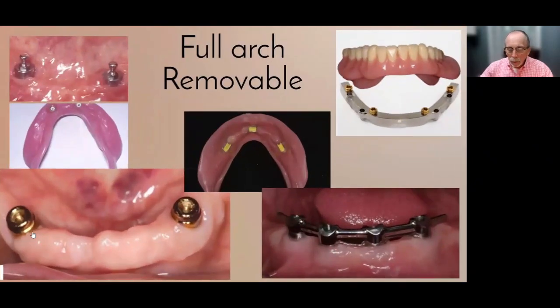So when you look at the spectrum of implant-supported edentulous restorations, you have to start with these because this is still by far the most common, the most widely used restoration to date for an edentulous implant patient. And that is what we affectionately call the Dolder bar or the Locator, right? The 2 lower cuspid bicuspids, 2 implants, 2 abutments, 2 clips in the dentures, right?